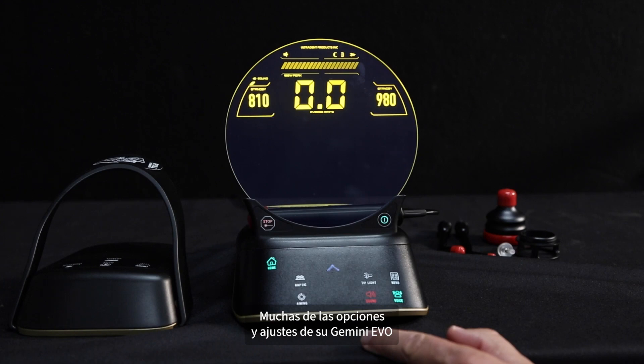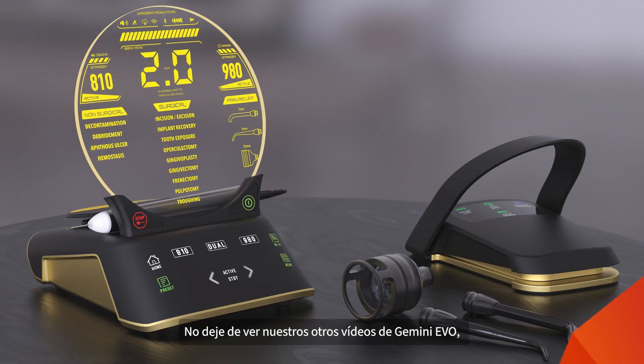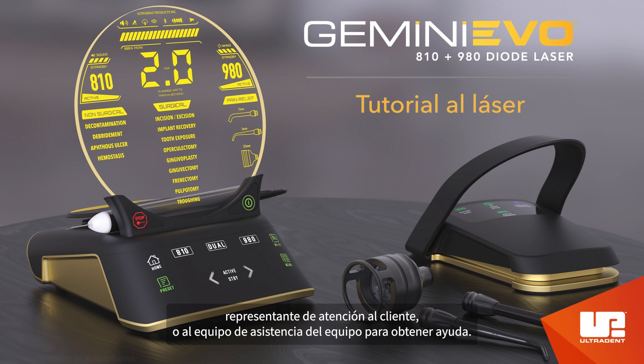Many of the options and settings of your Gemini Evo are customizable through the unit or the dashboard. This concludes the Gemini laser walkthrough. Be sure to watch our other Gemini Evo videos — unboxing and dashboard tour — for more information. As always, read the user's manual thoroughly before using your Gemini Evo diode laser, and if you have any questions, please contact your Territory Area Manager, Customer Service Representative, or Equipment Support Team for assistance.